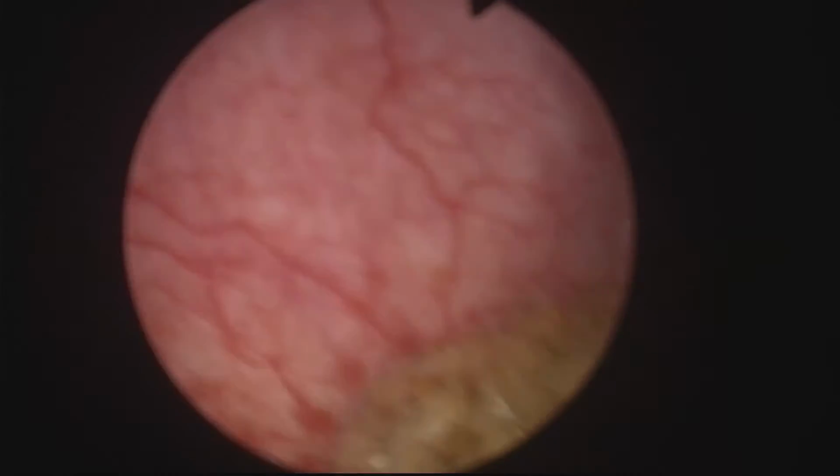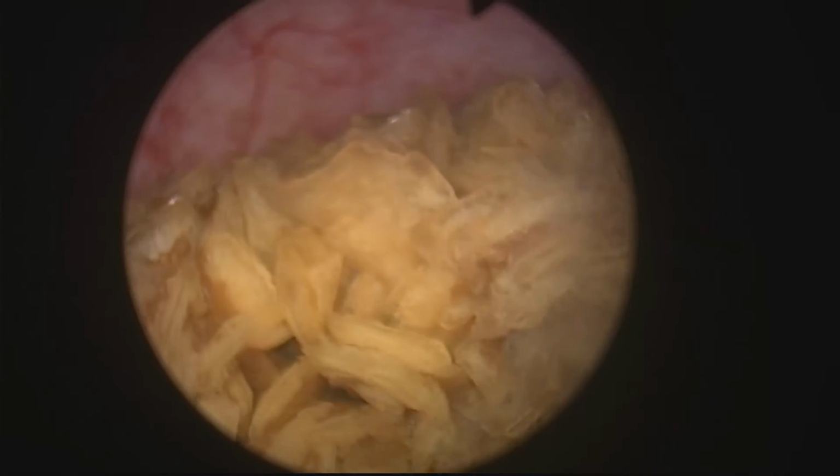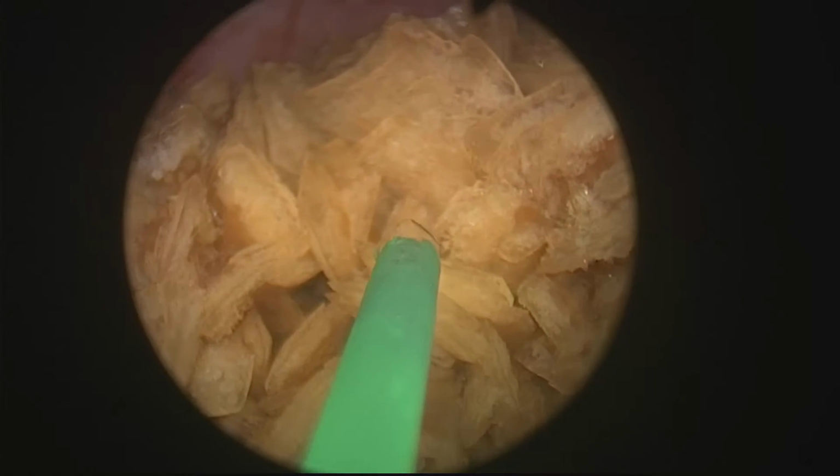This is the interesting case of a patient who was submitted to a TURP in the past, and he developed a stone in a bladder diverticulum. So we discussed his options. His voiding was not too bad.